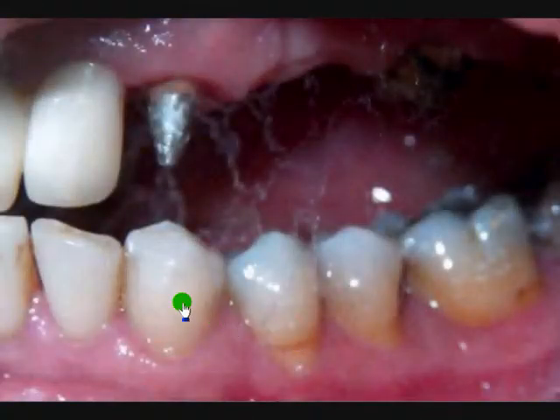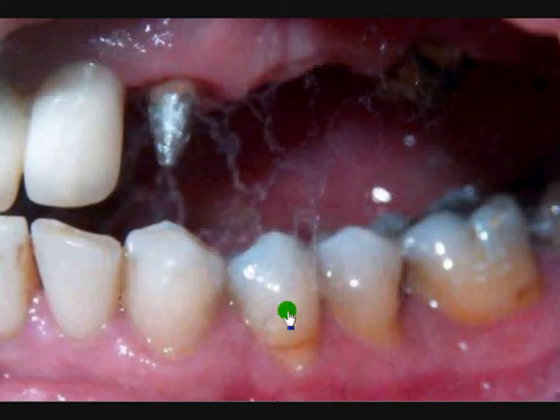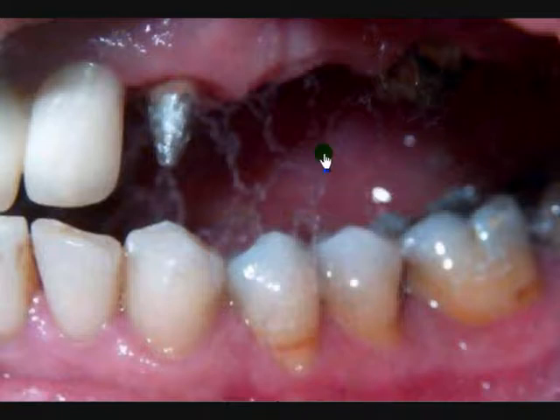I will proceed with mapping these four units down here, and I will do so even if our upper bridge from premolar back to the molar will be a different color, as we've seen on the shades, compared to these two premolars and to this molar.